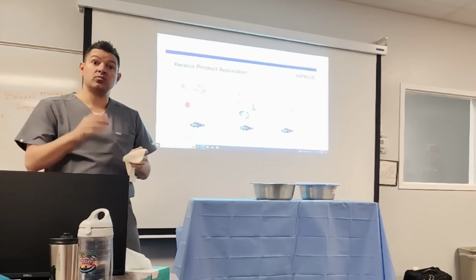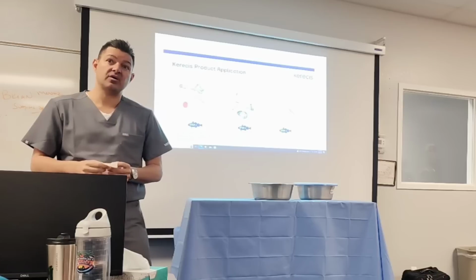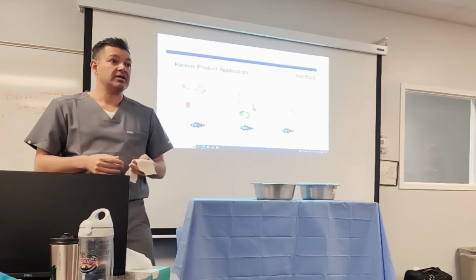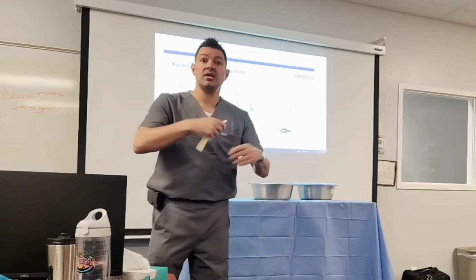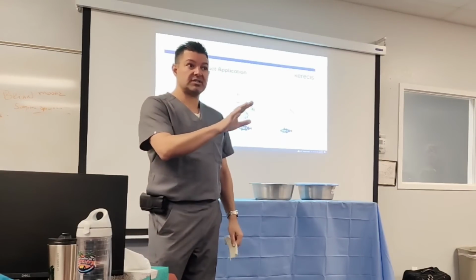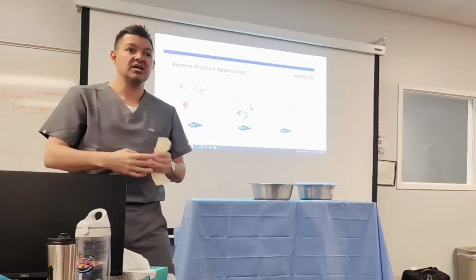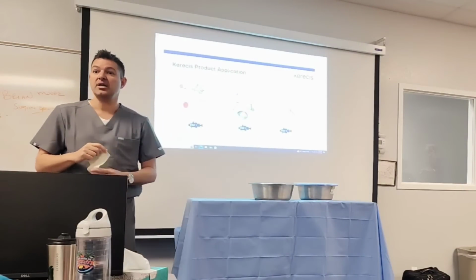Again, what happens is the patient goes up on the floor, and then within about 48 hours, doctor's and hospital preference, we'll pull back the dressing and pull back that veil, and take a visual look to assess the environment and see how it's going. Then we'll get a new veil, put some Vaseline on again to keep it moist, reapply it, put gauze over that as well, and then lay it down.